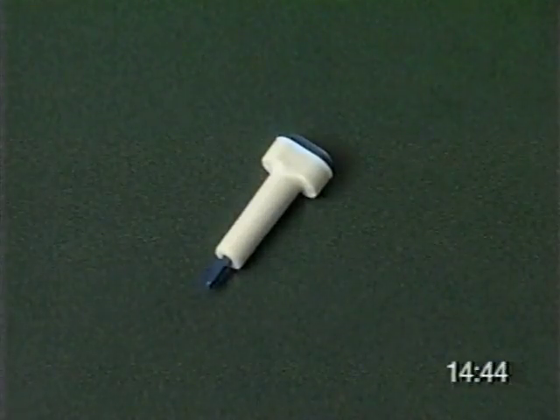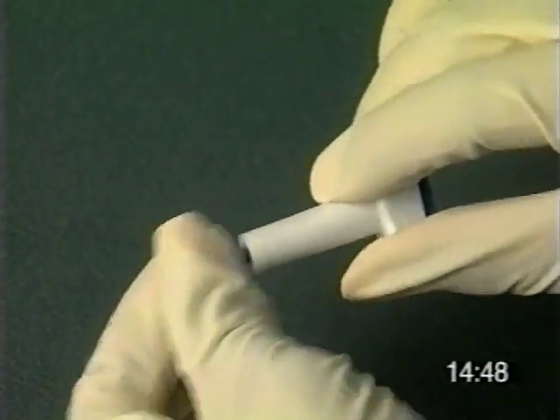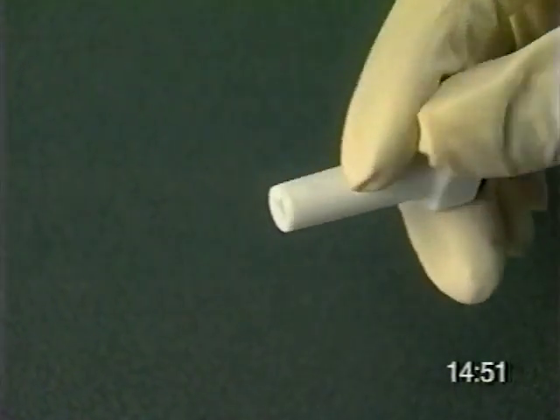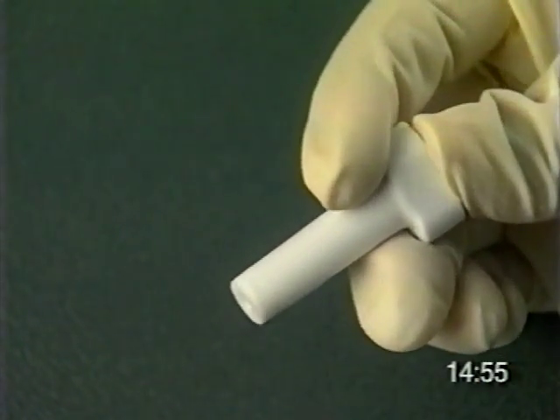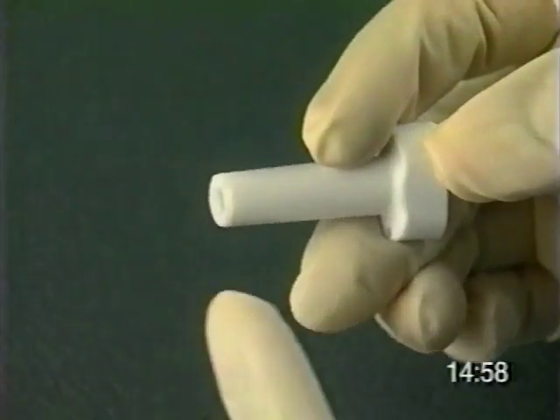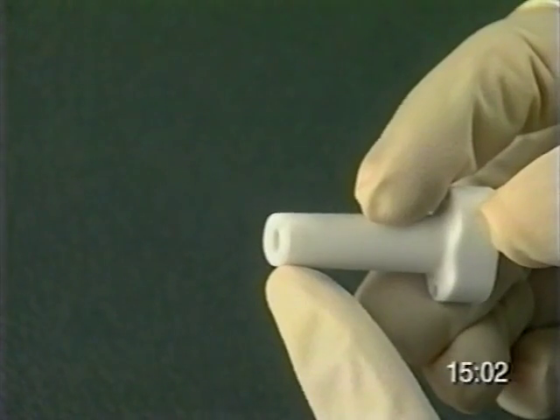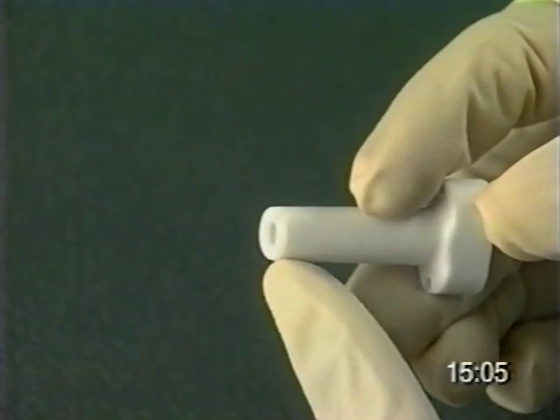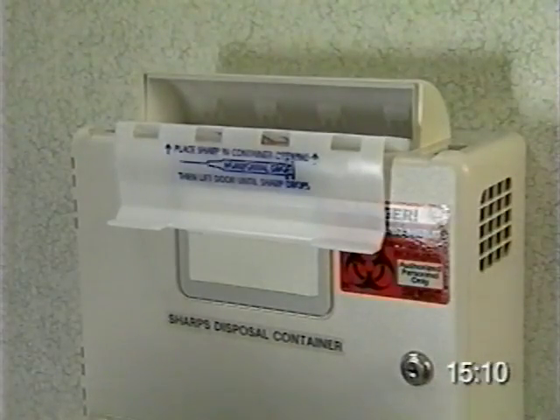The Coagucheck Safety Pro Lancet is a single-use device specially designed to prevent accidental finger sticks. Using the Coagucheck Safety Pro is simple. You just twist off the protective cap, place the tip firmly against the fingertip, and then press the blue trigger button. After you use it, the Lancet permanently retracts into its protective case to prevent any accidental finger sticks. Then discard the device according to your facility's established protocols.